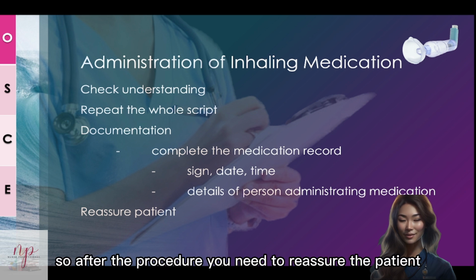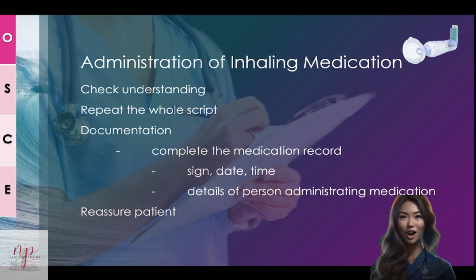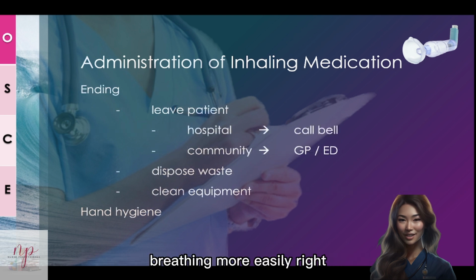Okay. So after the procedure, you need to reassure the patient. You need to ask if the patient is alright. Are you feeling better now? Normally he should be feeling better, because after the bronchodilator, he should be breathing more easily, right? And then you need to end it well, end it nicely.